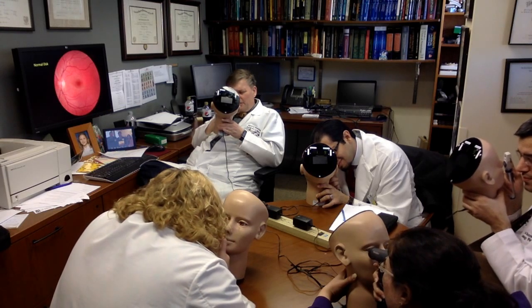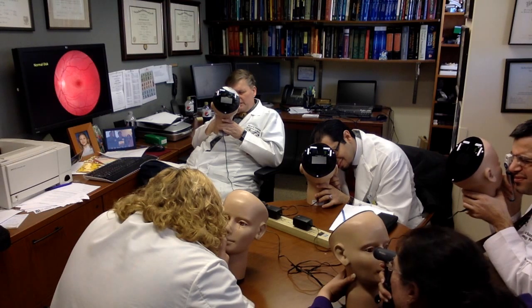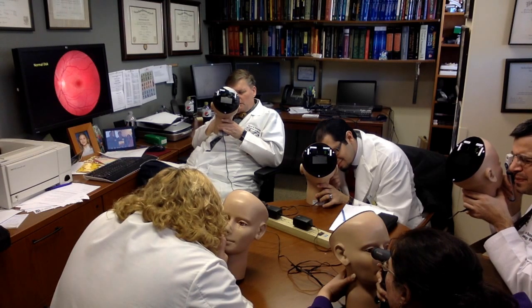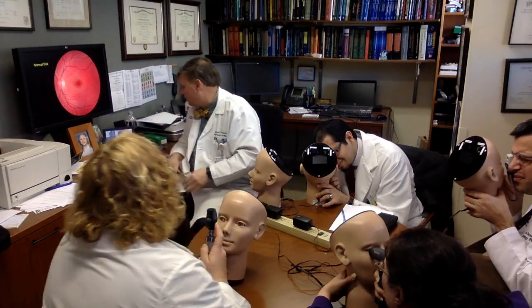Then let's go back to the disc and look at how the arteries and veins leave the disc, especially the big vein at approximately 7 o'clock. You see the big vein at 7 o'clock? Mm-hmm. It just runs straight out, right? It just runs straight out. Okay, good. So that is the normal fundus.